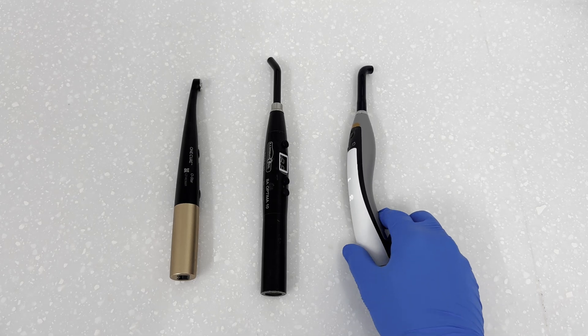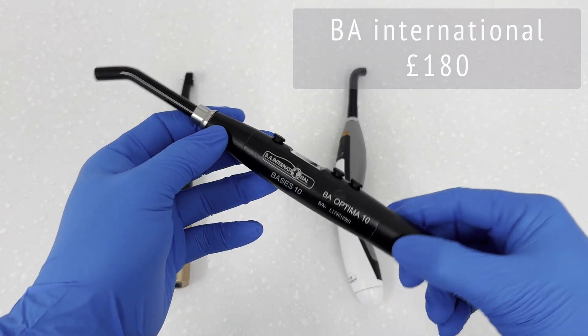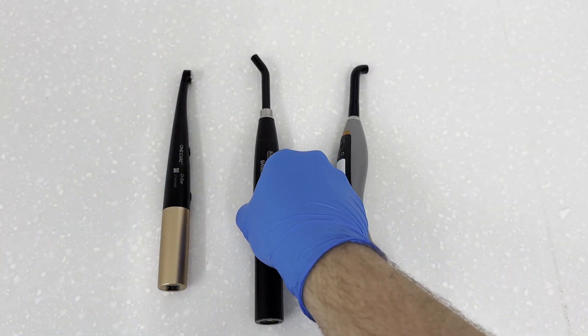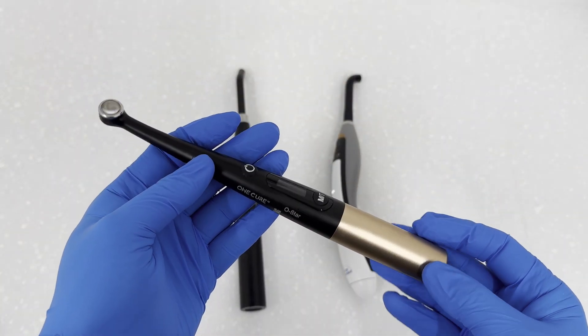For a comparison, we have three curing lights here: a premium Ivoclar unit retailing for around £900 from Henry Schein, a cost-effective BA International light at around £180, and the Ostar. The first thing you notice is how slim and small the Ostar is. During a long composite bonding session, holding a heavy curing light can make your hand ache significantly — the relatively light Ostar should reduce that considerably.